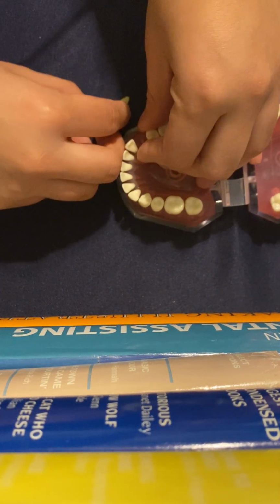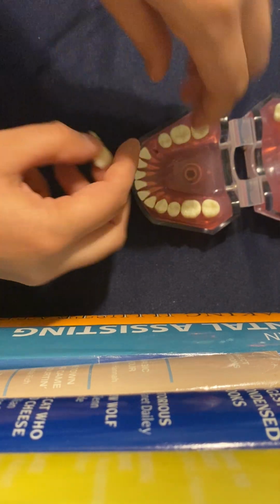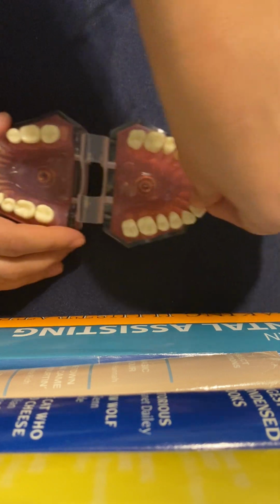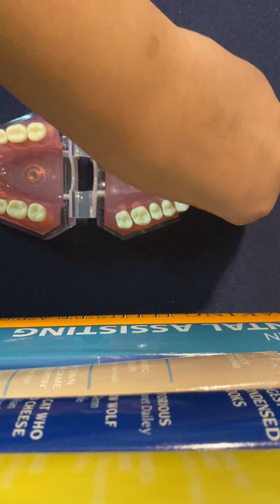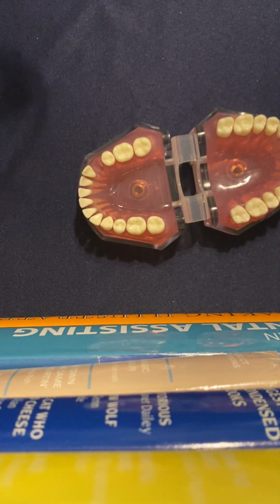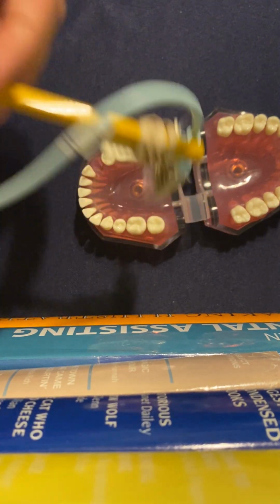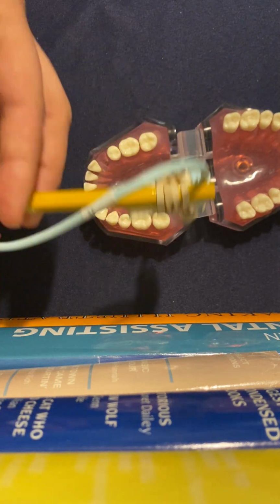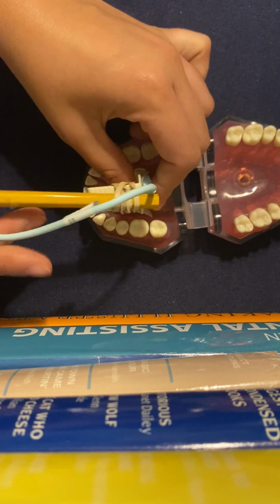Okay. So we did number 4. Now we're doing number 5, the mandibular central canine incisors. So we're going to do these. You're going to want to hit the midline, definitely that midline. You're going to want to kind of push that tongue back if you can.